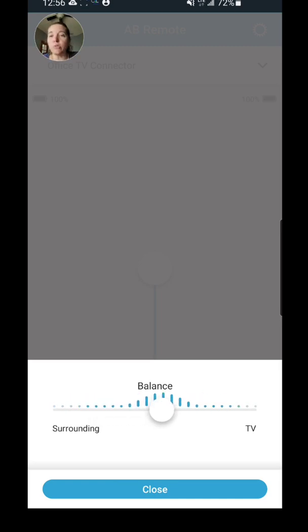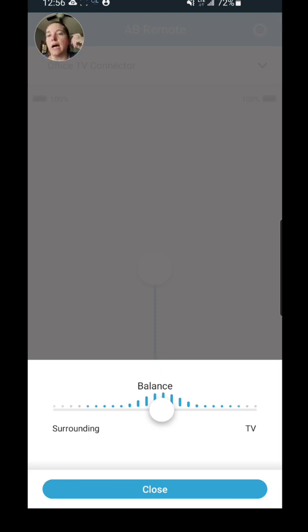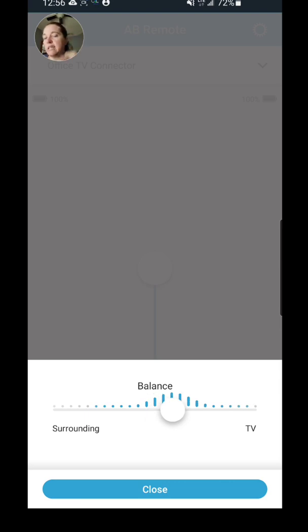This can also be done through the processor. So if you are in a streaming signal and you want to adjust the balance and you want to hear the streaming signal more than the environmental balance, you're just going to do a short press on the multi-function button up. You'll see the little app indicator move over as it increases.